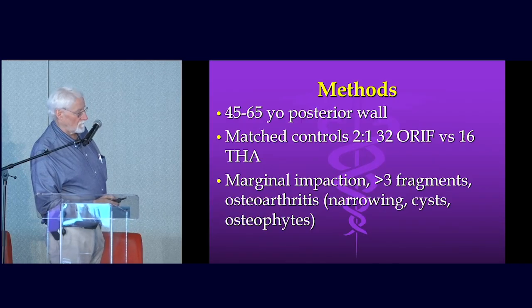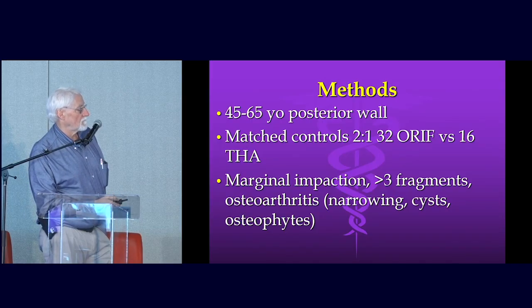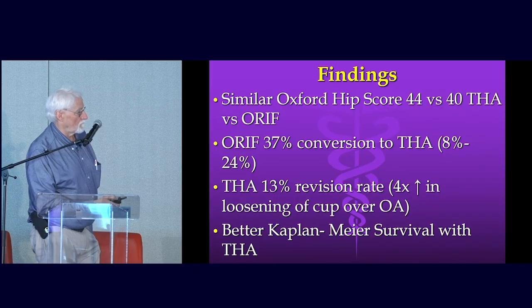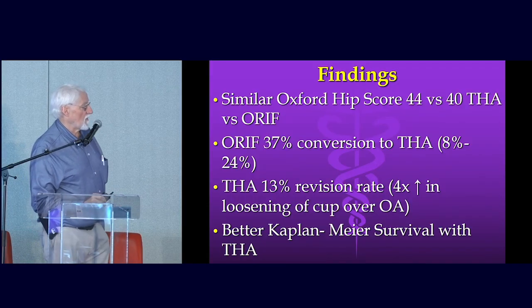We're trying to pick those patients, just like we were routinely doing acute or immediate total hips on patients in the 50-year plus age range, which I'm now well beyond, with a displaced femoral neck fracture. So if they've got a similar lesion on the acetabular side, why not just do an acute total hip? It's fairly easy to do a total hip on a posterior wall fracture. Yeah. So that's what this series was theoretically looking at.